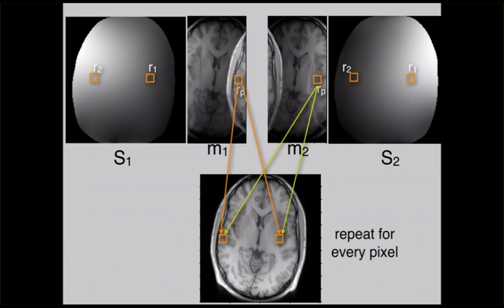So what's happening is that we take these two aliased pixels, one pixel here and one pixel here, and then we perform a weighted linear combination of these based on this reconstruction matrix to get the value of the pixel here. And then we take those two aliased pixels and do a different linear combination to get this value. And then we do that for every single one.